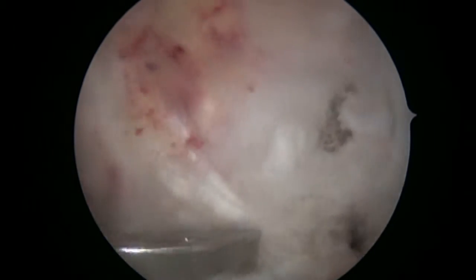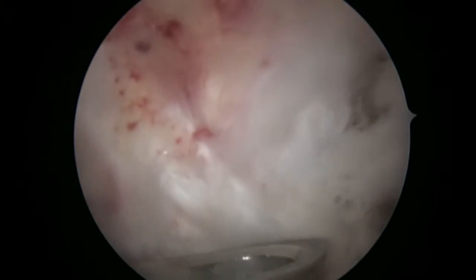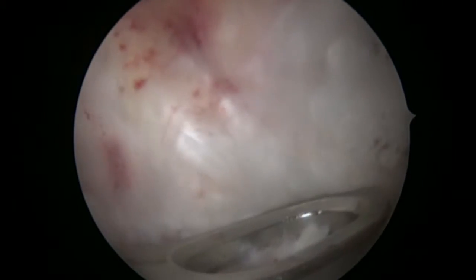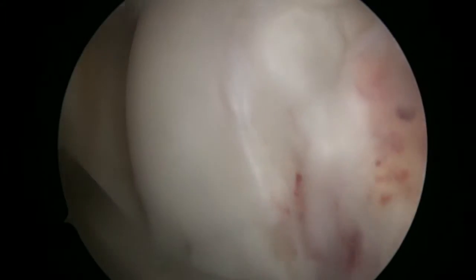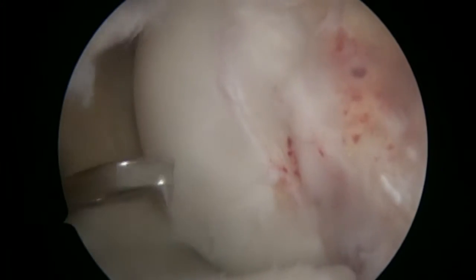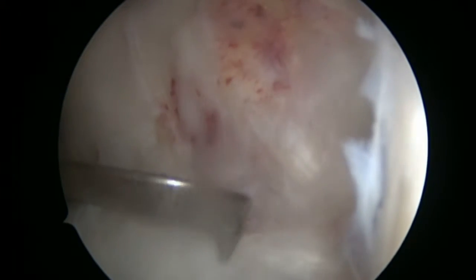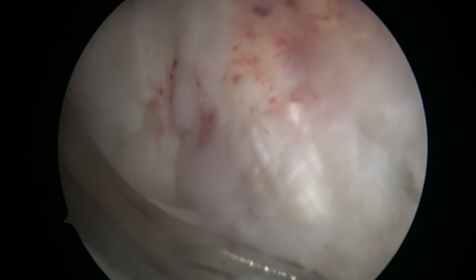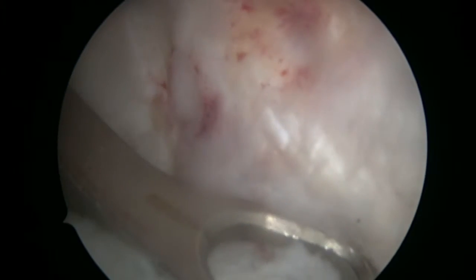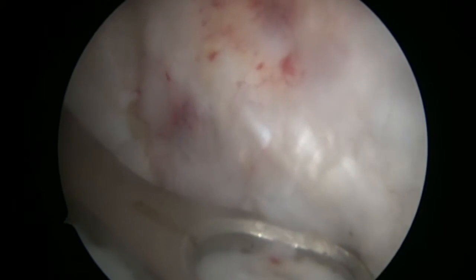We are planning the tibial drill to accommodate the graft on the shin bone, or tibia. This is an arthroscopic procedure, so everything is done through the keyhole other than taking the graft. The advantages of an arthroscopic procedure are: faster recovery with regards to the knee and shoulder joint, you are able to get back to activity sooner, postoperative pain is less, you have fewer scars, and the risk of infection is minimal.